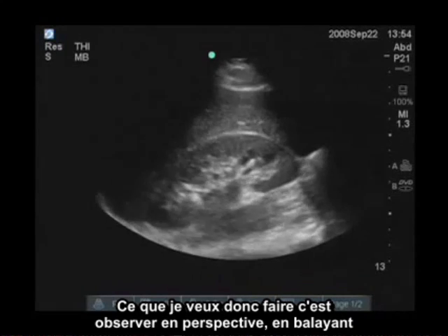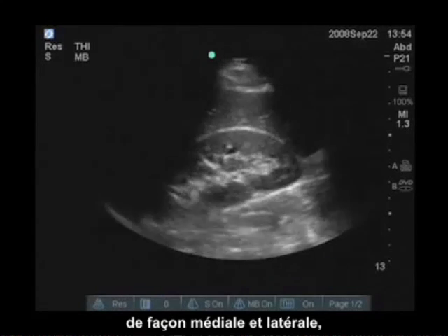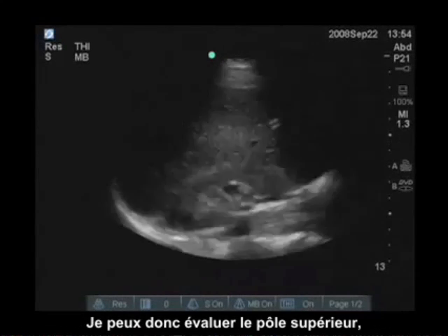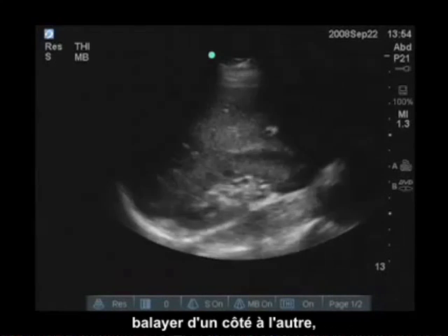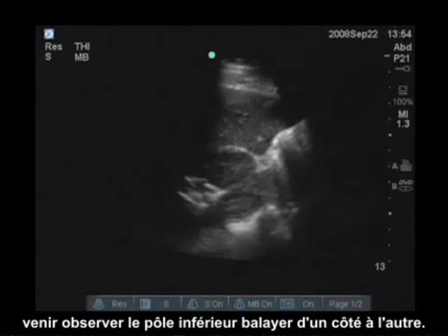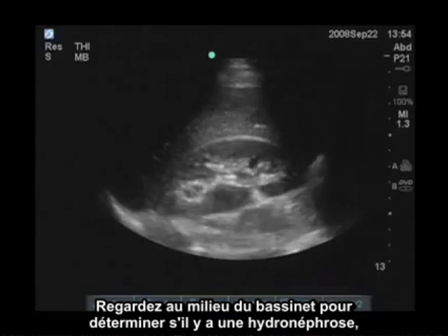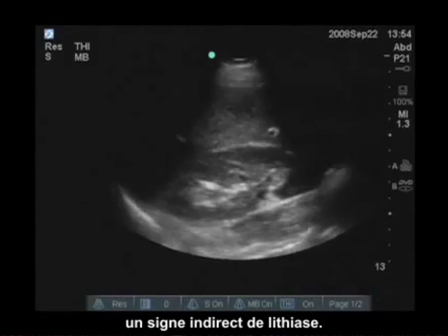What I want to do is evaluate in a long view, sweeping medially and laterally, looking at the cortex to determine if there are any echogenic or bright shadowing stones. So I can evaluate the superior pole, sweep from side to side, and then look at the inferior pole, sweep from side to side, and look in the mid pelvis area of the kidney to determine if there's hydronephrosis, an indirect sign of nephrolithiasis.